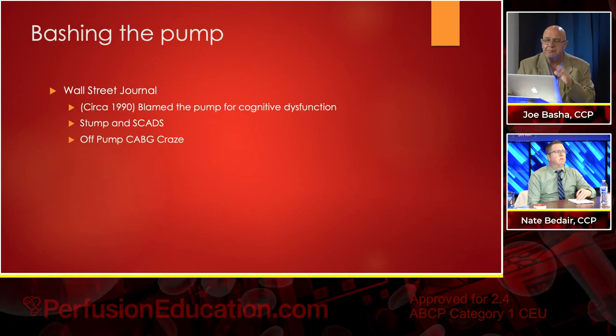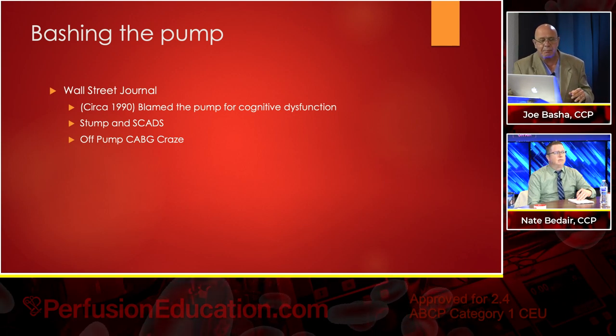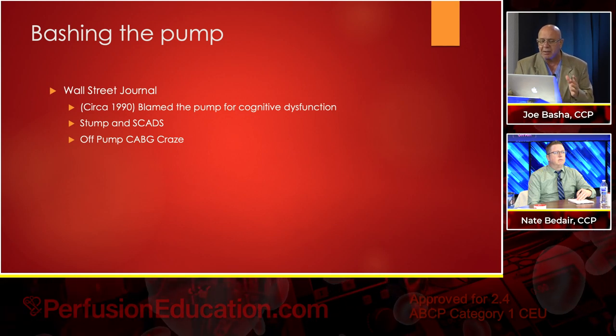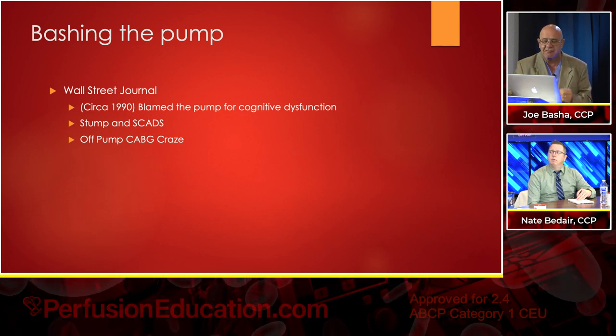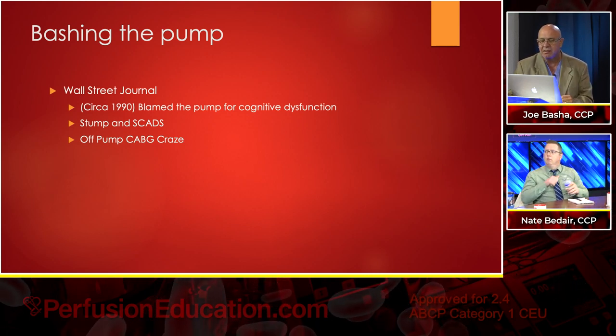So there was this big deal about bashing the pump. Going back to 1990, it was the pump head syndrome, right? And it was in the Wall Street Journal. They blamed the pump for cognitive dysfunction associated with open heart surgery on the heart-lung machine.